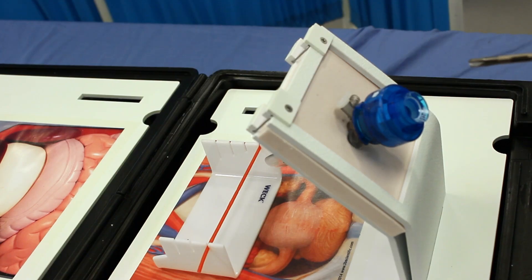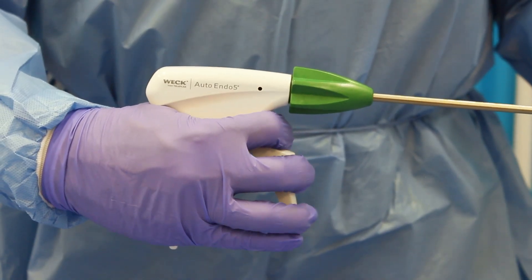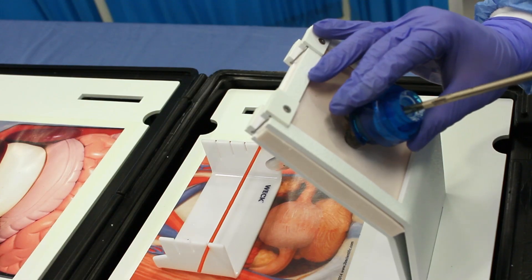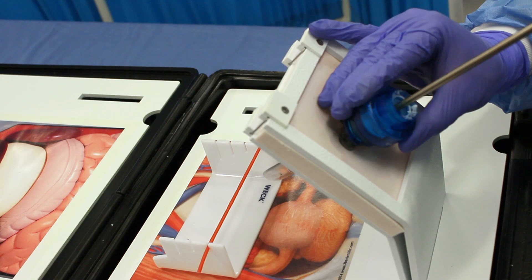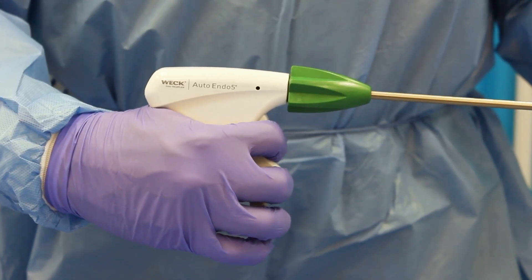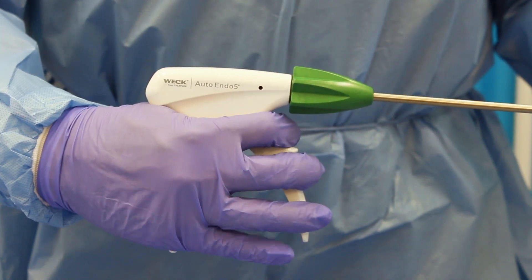To insert the applier through a cannula, squeeze the trigger until the jaws close sufficiently to permit entry into the cannula. Do not pull the trigger far enough to completely close the clip. Insert the applier jaws and shaft down the cannula. Once the applier jaws are visible past the distal tip of the cannula, release pressure on the trigger to return the clip to full aperture.